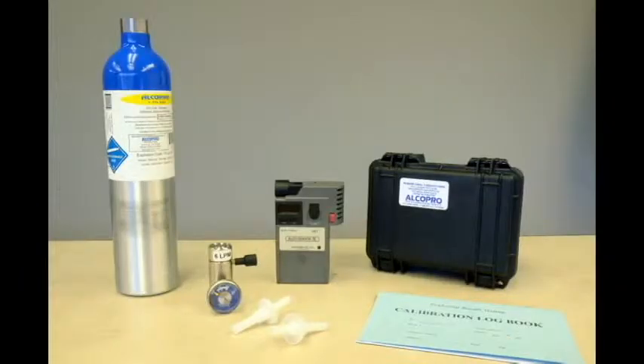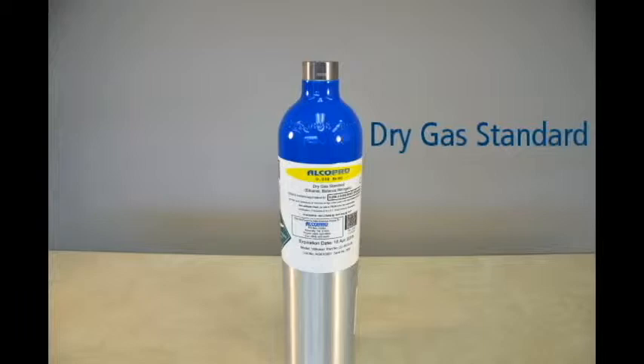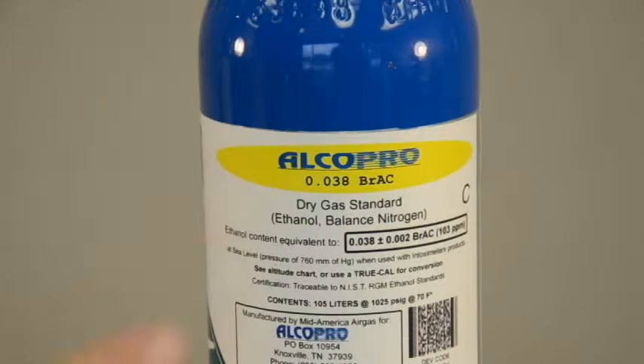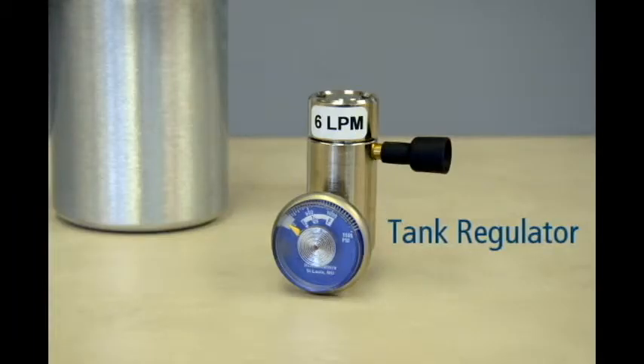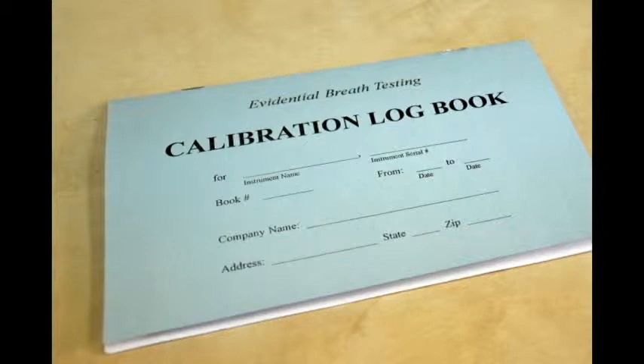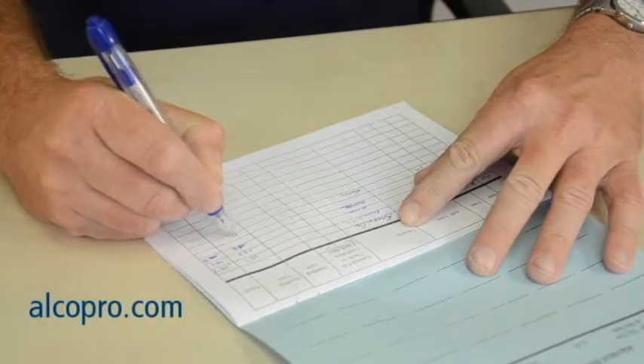To perform an accuracy check, you will need the following materials: your Alkosensor 4 with Memory device and a new mouthpiece. You will need an alcohol gas standard — we will be using a dry gas standard with an ethanol content of .038 BRAC at sea level. The dry gas standard concentration can be located on the gas tank label. You will also need a tank regulator to attach to your dry gas tank. It is a good idea to keep a logbook of accuracy checks and calibrations performed on your device. You can purchase an accuracy check calibration logbook at alkopro.com.